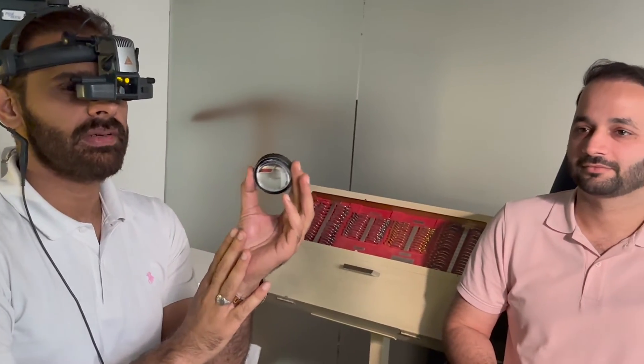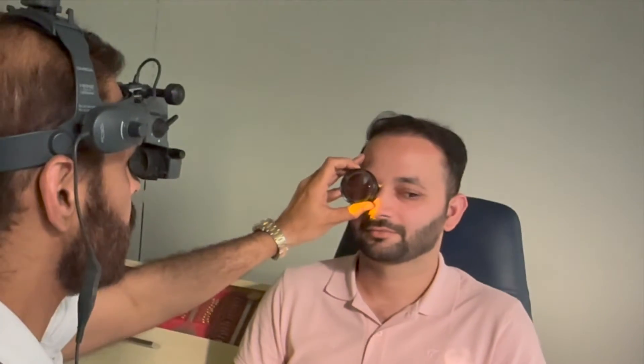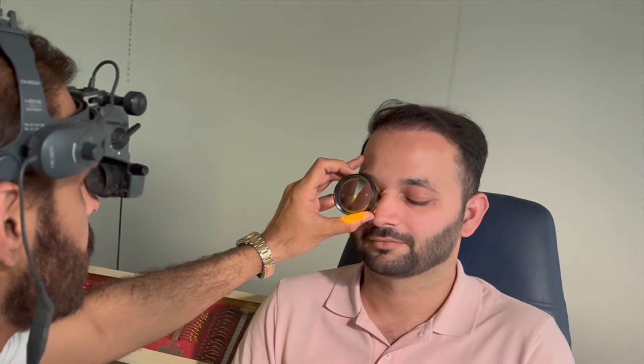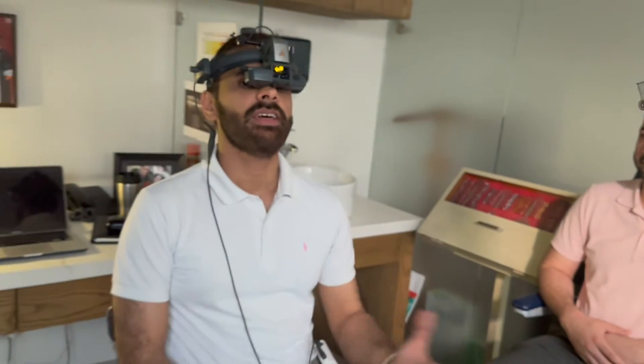For the right eye with the indirect hat, hold the lens in your left hand, ask the patient to look at your right ear, introduce the condensing lens, and look at the posterior pole. To examine the extremities, ask the patient to look up and left, then left, then left and down, then down, then down and right, then right, then right and up.